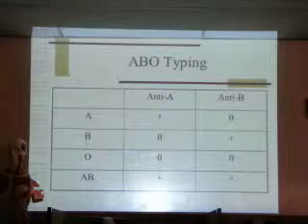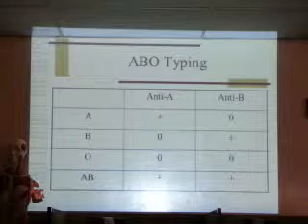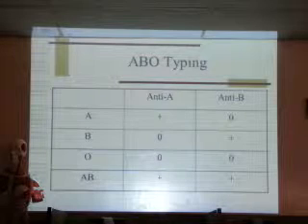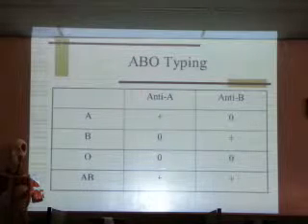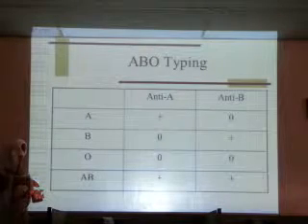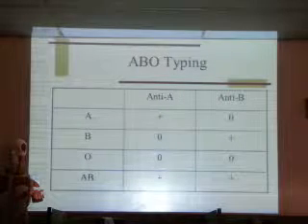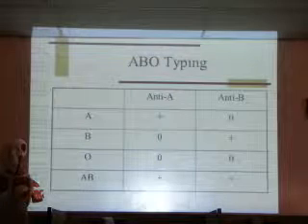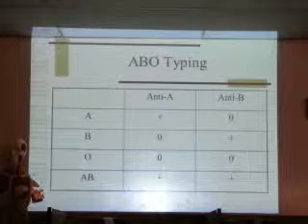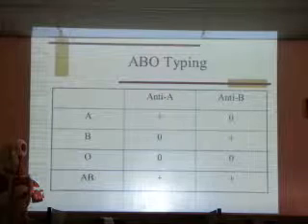So what was it that Dr. Landsteiner and his colleagues were looking at? Well, they categorized the blood, and they have the A, B, O, and AB groups, and then they have anti-A and anti-B. So they took the plasma from patients that are B and they possess anti-A. They took the plasma from A patients that are anti-B. Okay, so we consider these reagents because we know that it's anti-A and anti-B.